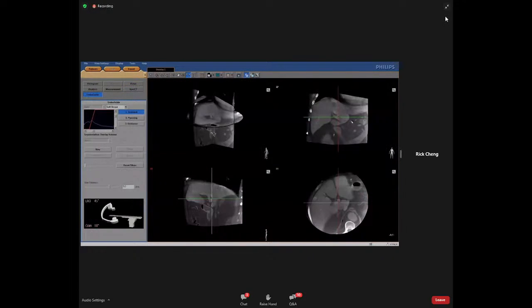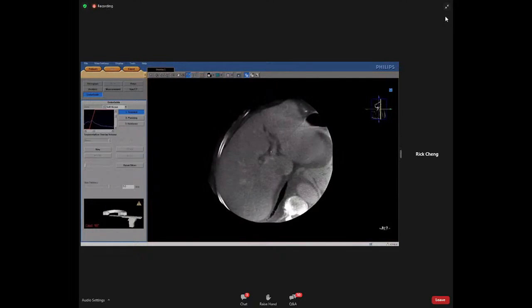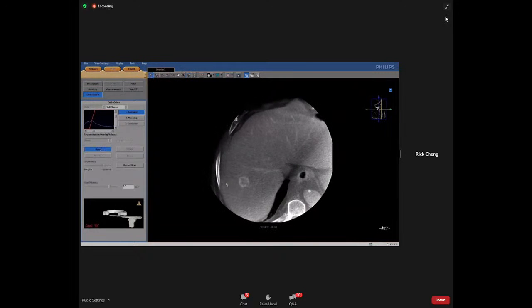Proceed to the Embo Guide application. The application opens automatically in the segment step. The late phase will be visible and the arterial phase will be hidden. Select a single viewing pane and scroll through the cone beam CT volume to identify the lesions for treatment.